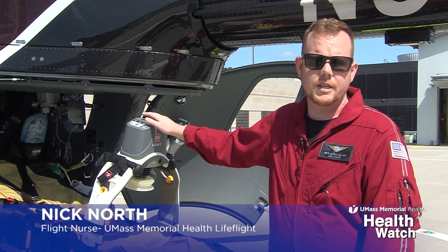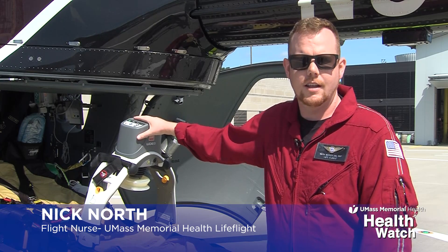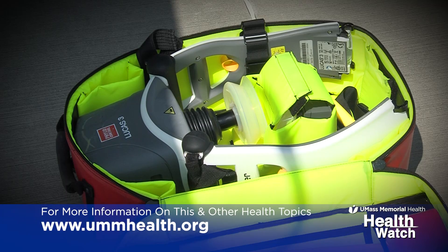This is the Lucas 3 device. It's an automated chest compression device that allows for continuous, automated, uninterrupted chest compressions to be administered to a patient in the event that their heart stops.